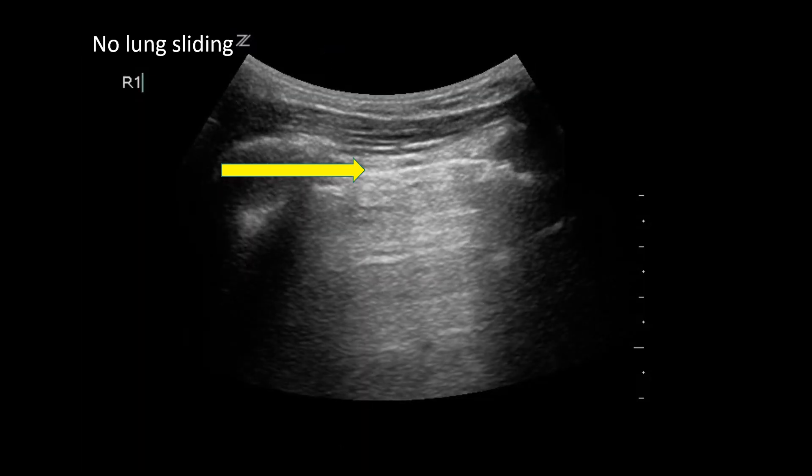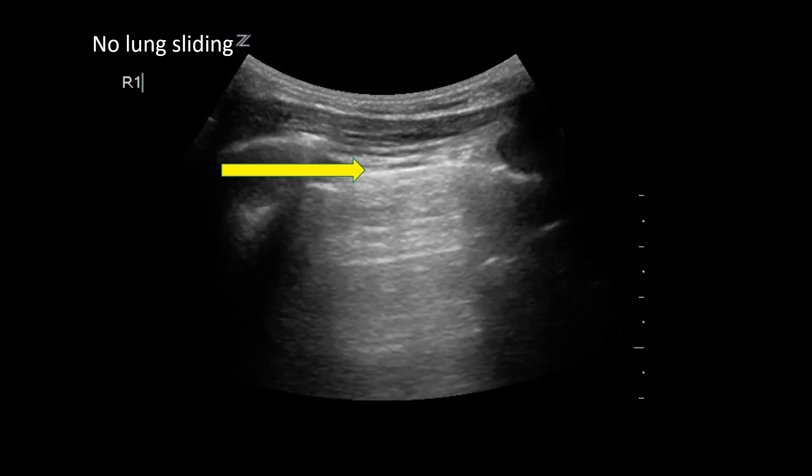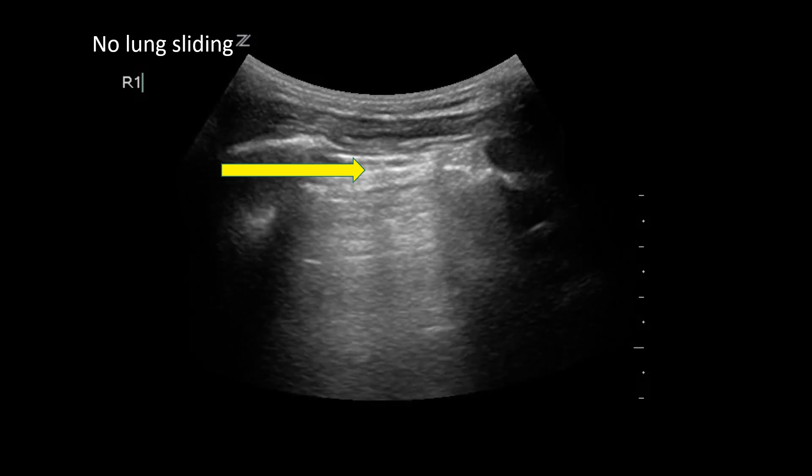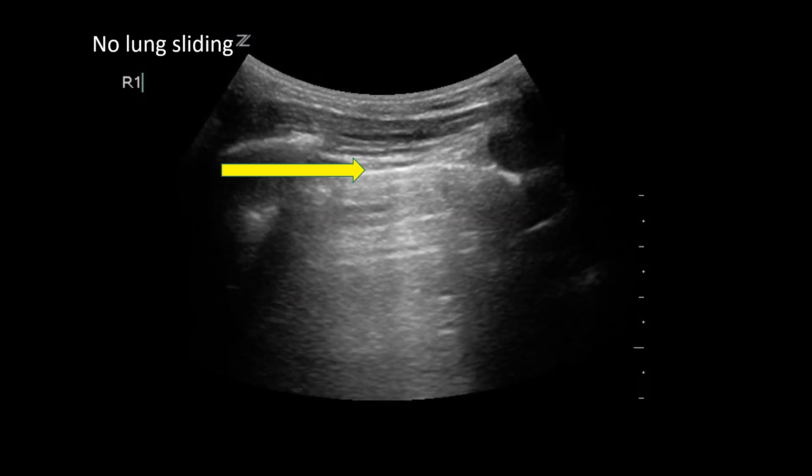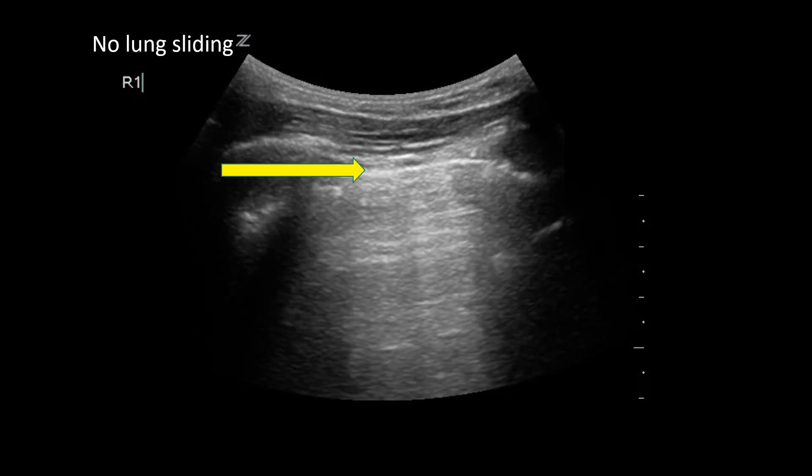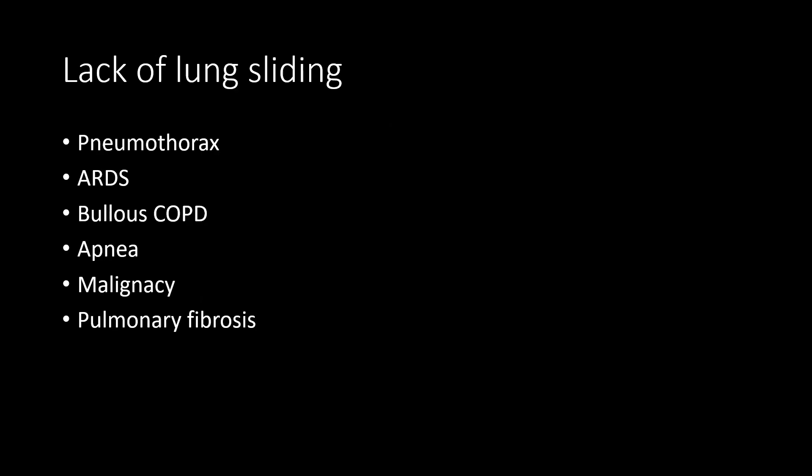This slide demonstrates a lack of lung sliding, demonstrated by the yellow line. Lack of lung sliding can be seen in pneumothorax, but there are other potential causes, including ARDS, bullous COPD, apnea, malignancy, and pulmonary fibrosis.